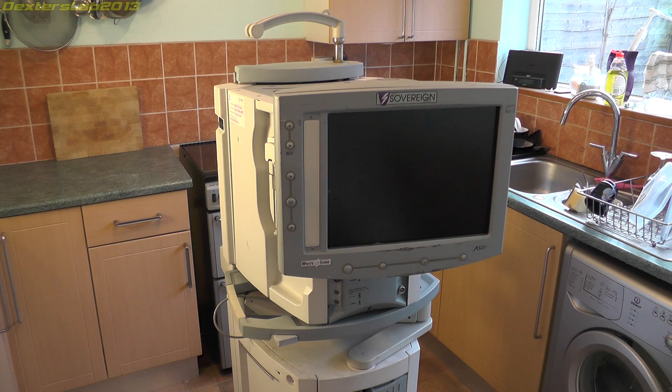Now before I go into too much detail about this machine, there's a little bit of a story about how I came across it. Mike from Mike's Electric Stuff tipped me off about this one because he spotted that it was local to me. And yes it was — only maybe a 15 minute drive away.